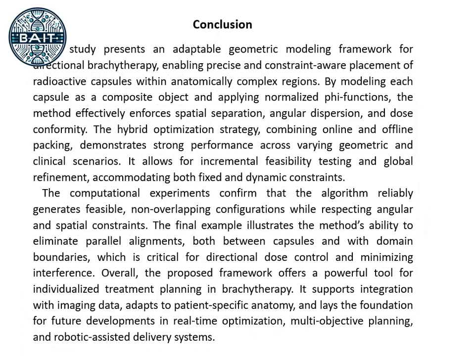Conclusions. In this study, we present an adaptable geometric modeling framework for directional brachytherapy, enabling precise and constraint-aware placement of radioactive capsules within anatomically complex regions. By modeling each capsule as a composite object and applying normalized phi-functions, the method effectively enforces spatial separation, angular dispersion, and dose conformity.